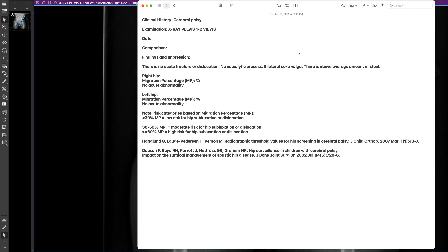This is the template that we have that you can use to report these migration percentages — right hip and left hip. We give some numbers as guidance: less than 30 percent, between 30 and 59 percent, and greater than or equal to 60 percent. This stratifies what the risk is, and here are a couple of references for that.